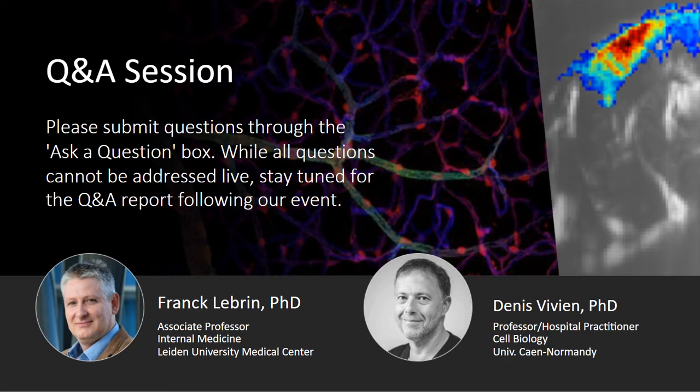Actually, we do that in collaboration with Michael Tanter's lab, and they have developed software, so they track the microbubbles, right? And then they can make the right position. It's 2D imaging, so we don't have access to 3D, but I know that they have developed a 3D probe. I don't have access directly to the software, but I know that now it's developed by the Iconeus system. So they have directly made that, right?